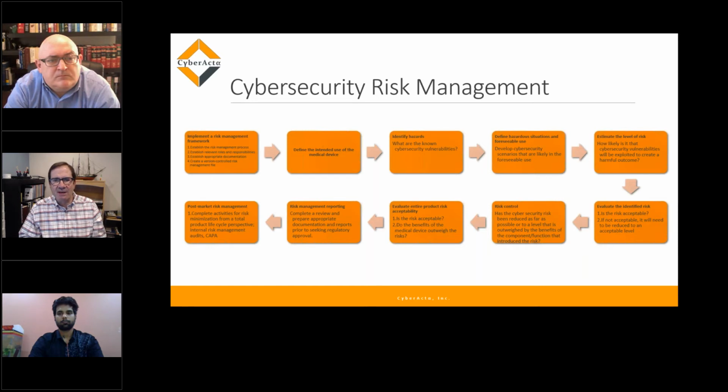An example that I've heard a number of times, you've probably heard as well, that I like to use to understand the difference between a hazard, a hazardous situation, and a harm, is if you're on a dock in front of the ocean and there's a shark in the ocean, okay? The shark is a hazard, okay? There's no hazardous situation while you're on the dock whatsoever, okay? There isn't a hazardous situation until you jump off that dock and get into the water with the shark. Now you've got a hazardous situation, and the shark may or may not catch you before you get back to shore. What's that chance of a harm occurring? Of course, the harm being that physical encounter with the shark. So that's a good example I like to use to understand the differences between all those nuanced terms.